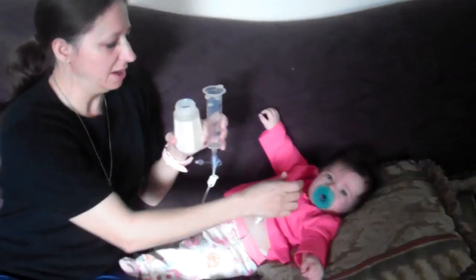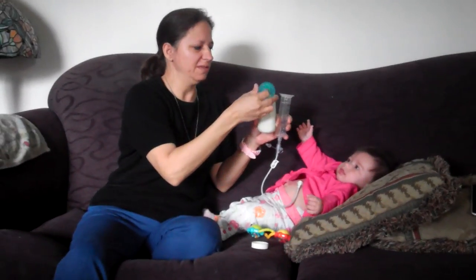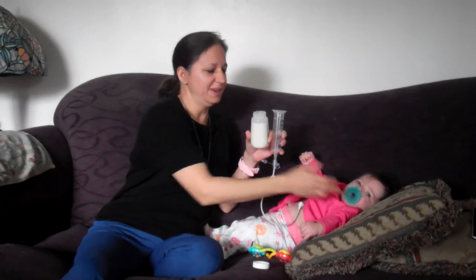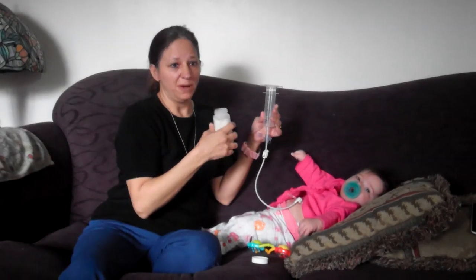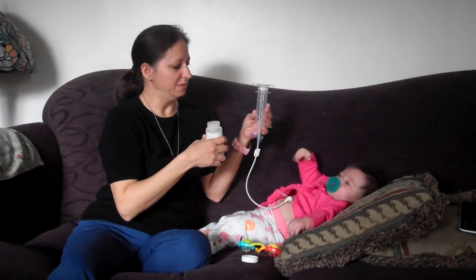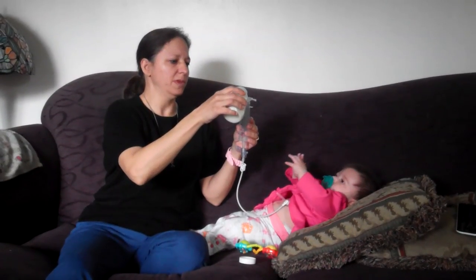Now with Hannah, we have permission from her pediatrician and her GI doctor to dip her binky. You don't want to do that unless your doctor tells you to. That is because she can associate the taste of the food and having the experience and the swallowing and all the connections that take place while we're filling her tummy with her food. And sometimes I'll do that throughout her feeding.